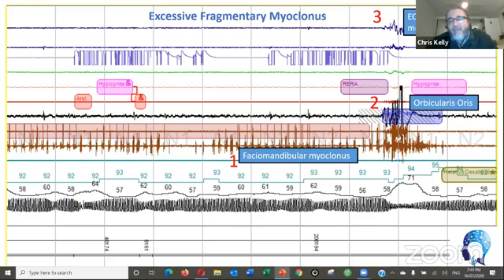And then just where you had your pointer before, if you go straight down to the black line there, it goes from 58 to 71. That's an increase in pulse rate over about 20 seconds. Like, what the? That's a sympathetic response from hell. So that's an intense response, and this is a TMD patient.